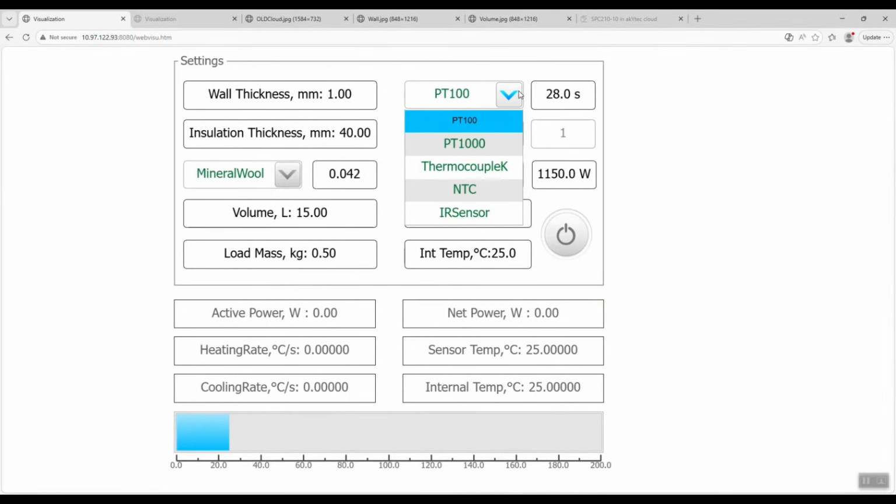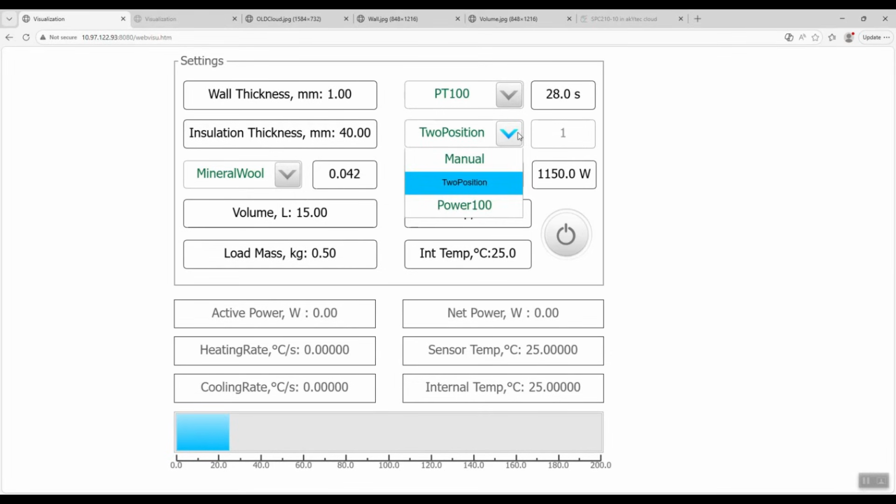We can choose different types of sensors, and for each type, we can also set the inertia or time constant of the internal temperature sensor. The higher this parameter, the slower the sensor responds to changes in the actual temperature inside the sterilizer chamber. The seventh parameter is the heater power control mode. We can select 2-position mode, 100-position mode, or manual mode.